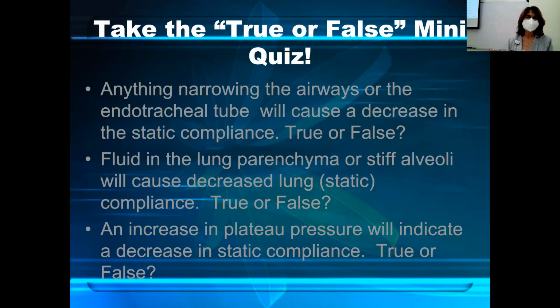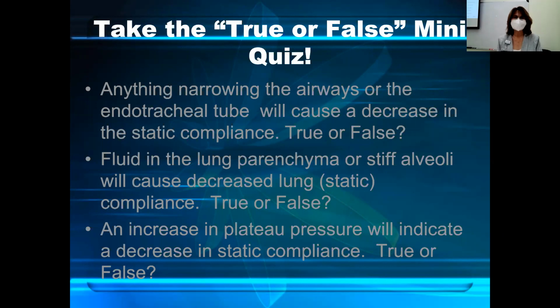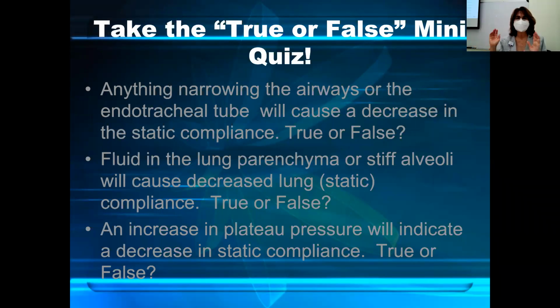Taylor thinks false. Okay, why did you think that, Taylor? I was thinking that because static is based off of the inspiratory hold, that has nothing to do with the resistance. So that's why I think it would be false. Perfect, good job. Yeah, static compliance has nothing to do with airway resistance. Airway resistance is taken out of that formula. You're only looking at the pressure in the alveoli.